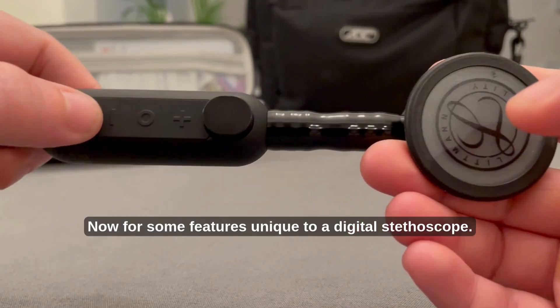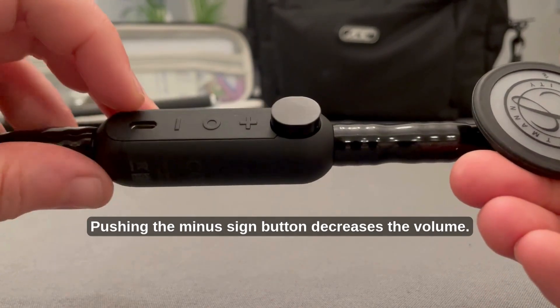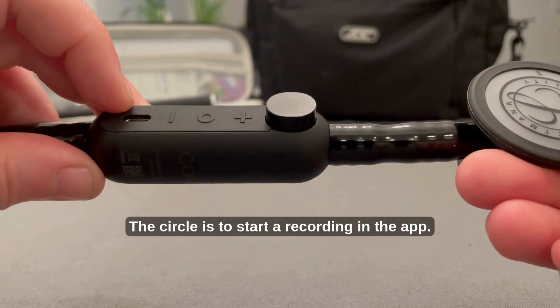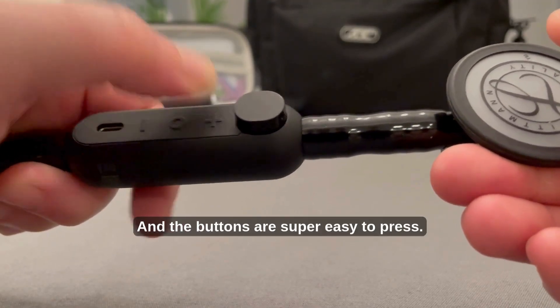Now for some features unique to a digital stethoscope. There's the charging port. Pushing the minus sign button decreases the volume. The circle is to start a recording in the app. And the plus button increases the volume. The buttons are super easy to press.